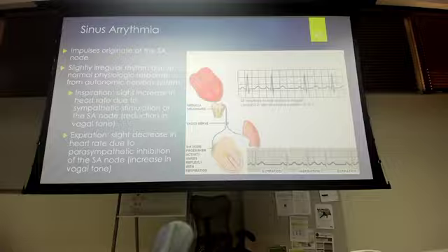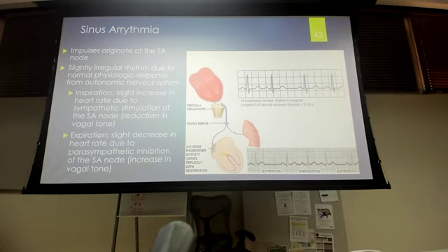What's going to happen is you'll notice that, and just watch the patient. Put your hand on their pulse, watch the patient's respiration. You can actually feel it increase a little bit and decrease a little bit while you're watching their respiration. It's like, oh, that totally coincides with their inspiration and expiration, not really the respiratory rate. And on EKG, you can see that. You don't see it very often.